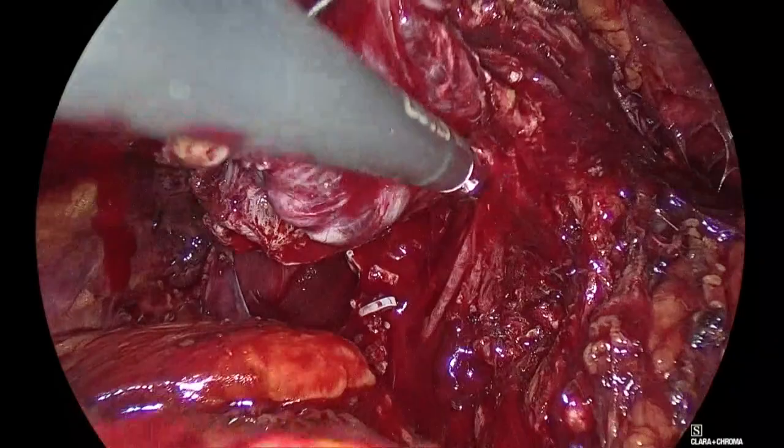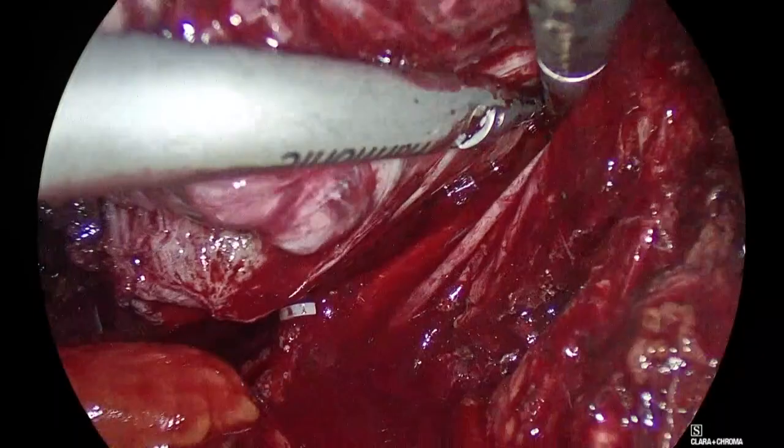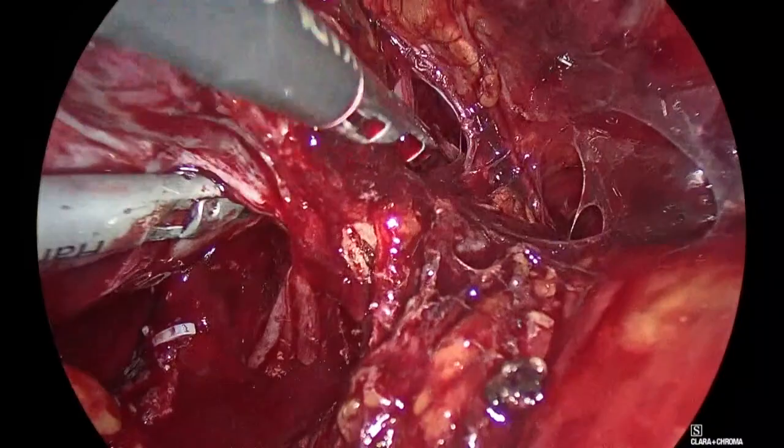I said, will it actually do the job? Now, this is also very nice. Look, we have the field here. We know that we are here. So what do we do? We just go lateral with this grasper. We go lateral like this, okay? We go lateral and it creates a field. And you see how nicely it comes out here? Now give me the scissors.